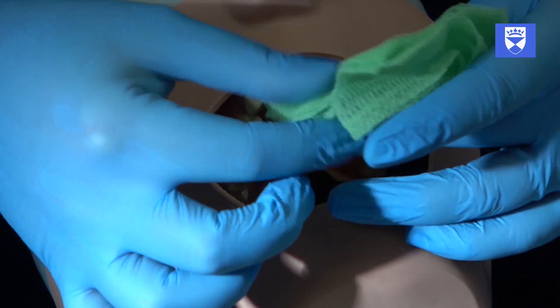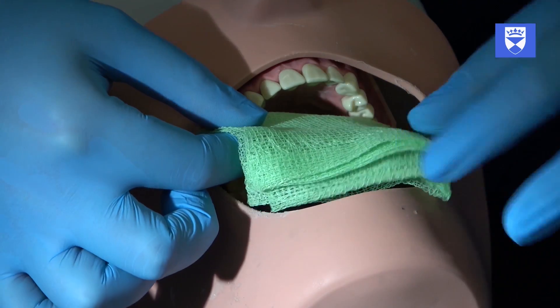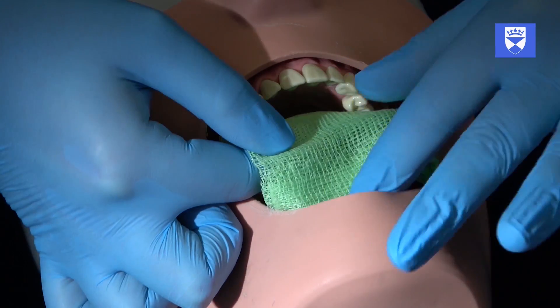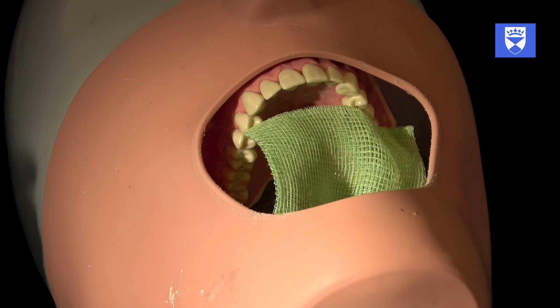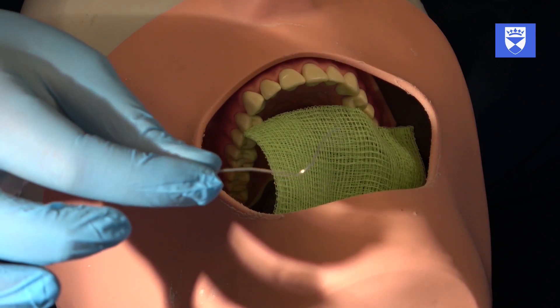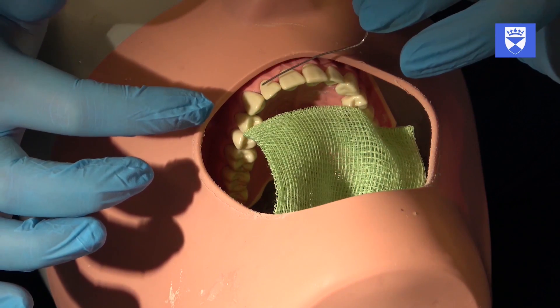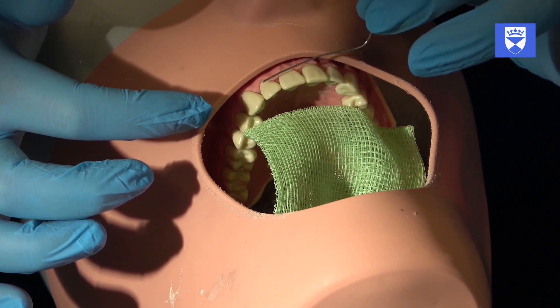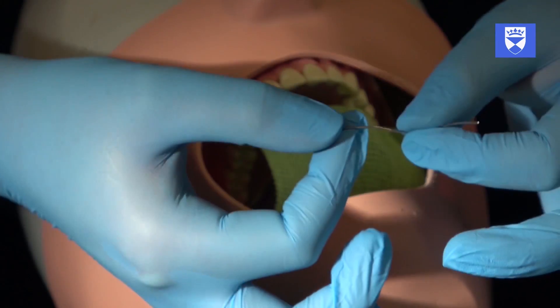If you are using wire from a reel, this will need to be cut. For all parts of this procedure, any wire cutting must be done safely. In the first method, we create a safety handle by cutting a larger piece of wire and bending it so that we have an approximate length of wire plus a large safety handle which we can hold and compare to the teeth, making modifications to ensure the appropriate size for the teeth we intend to splint.